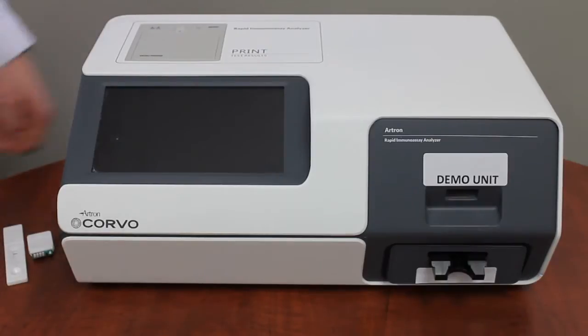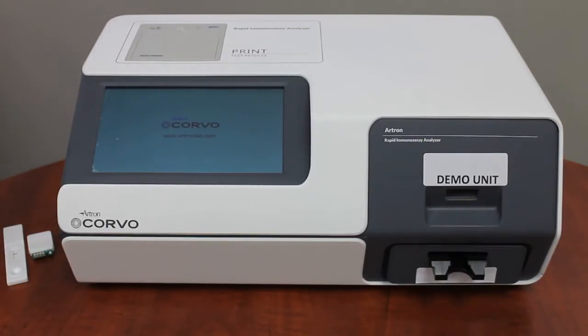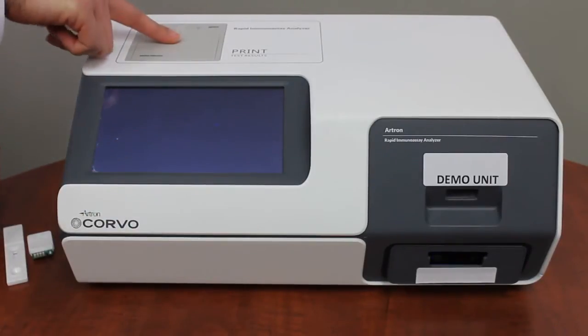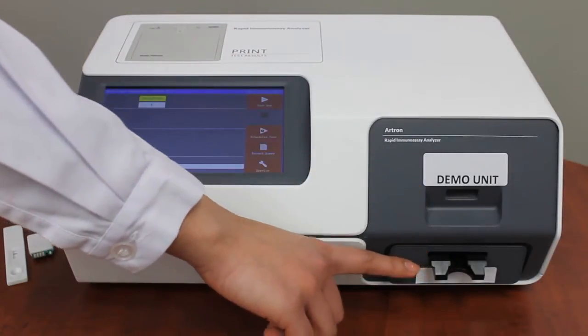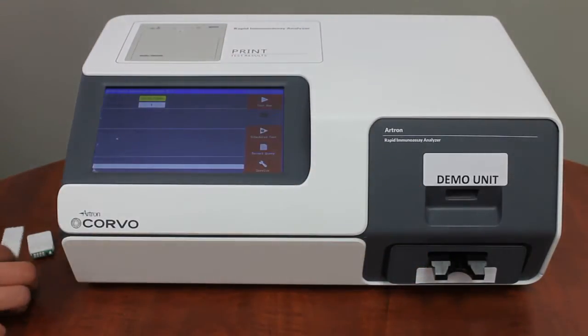You can turn the analyzer on through the power button on the back. The main components of the machine include a color touch screen, the printer, the ID slot, and the cassette slot, which is compatible with select RTRON cassette test kits.